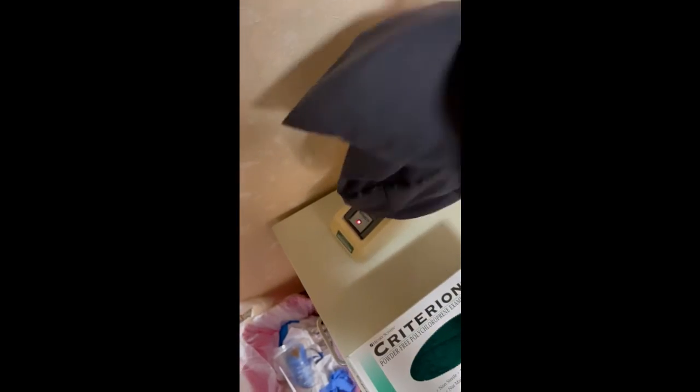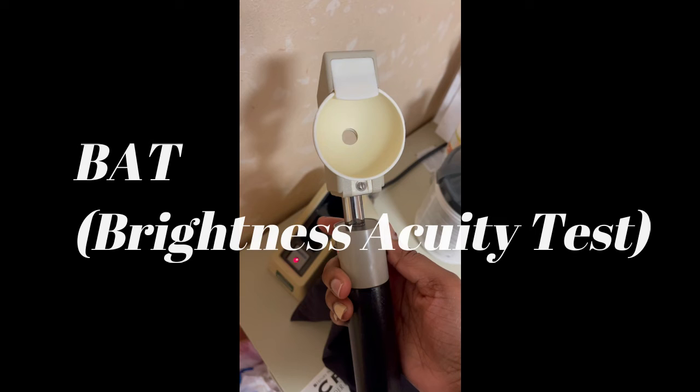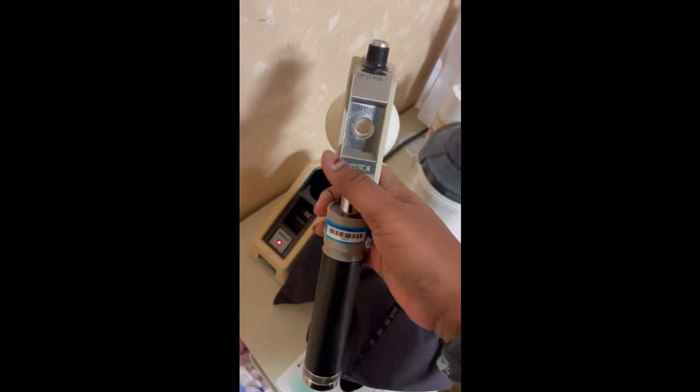This little gadget here is called a BAT — I'm not sure what that stands for — but we normally use this for patients who have issues with glare. It pretty much simulates glare from car headlights. The patient holds it up to their eye and it simulates car headlights while they try to read the chart with the light in their eye. That's very helpful — we do that a lot with our cataract patients.